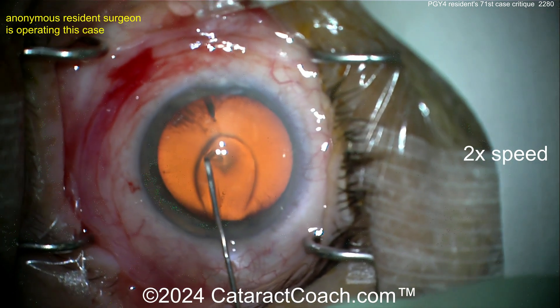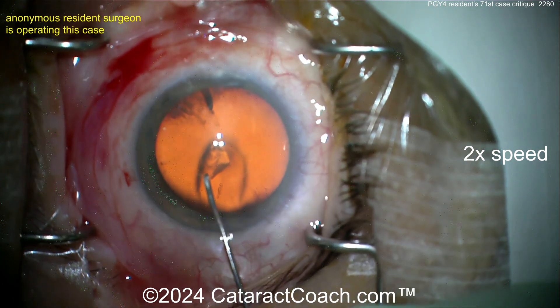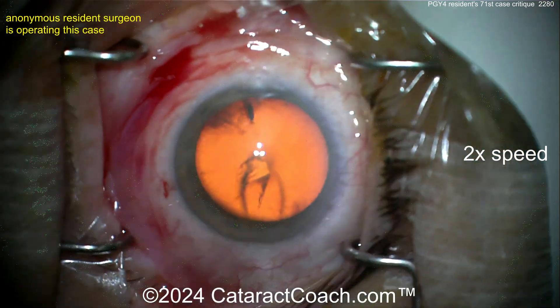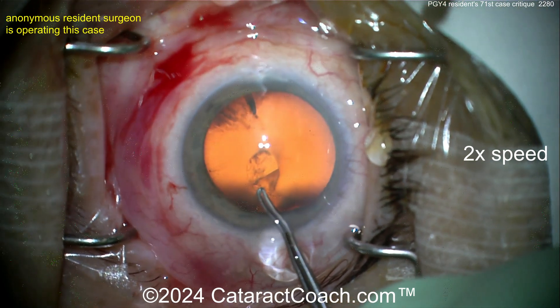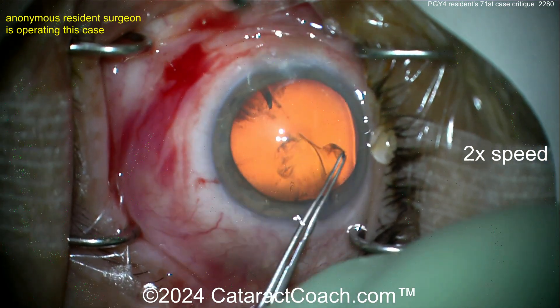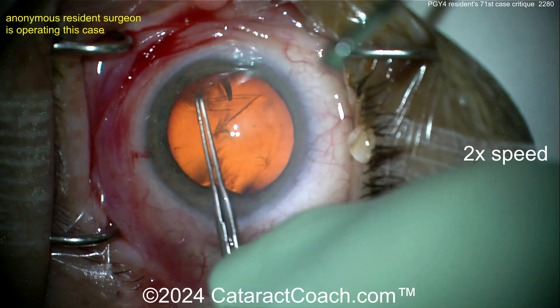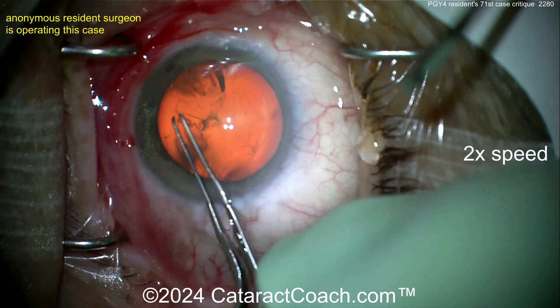Poking in the capsule, pulling that across, getting that capsule flap turned over — there it is. There's a good video on CataractCoach about capsulorhexis danger zones — search 'danger zone' on cataractcoach.com. Now grabbing the capsule and going around. Not sure exactly how big the rhexis is — these forceps aren't marked, probably about a 6 mm rhexis, maybe a little generous.